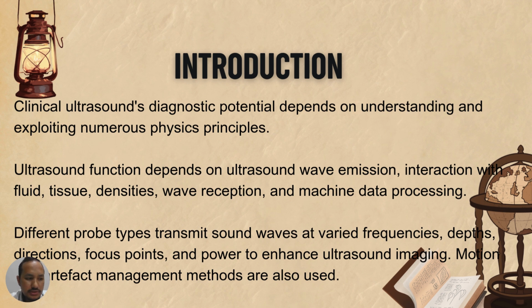Firstly, amplitude. Second is frequency. Third is wavelength. Fourth is speed. And last is period. Clinical ultrasound diagnostic potential depends on understanding and exploiting numerous physics principles. Ultrasound function depends on ultrasound wave emission, interaction with tissue densities, reception, and machine data processing.